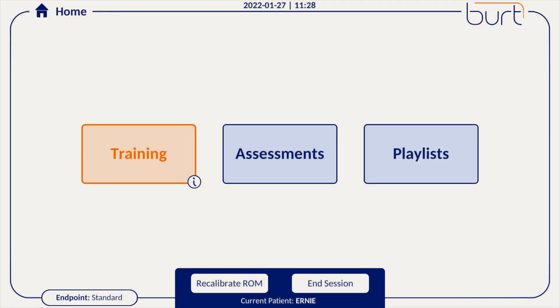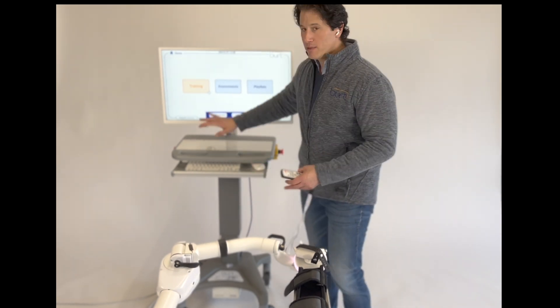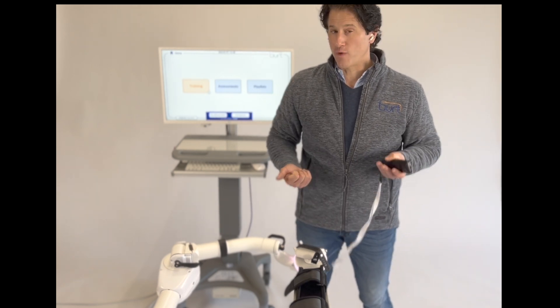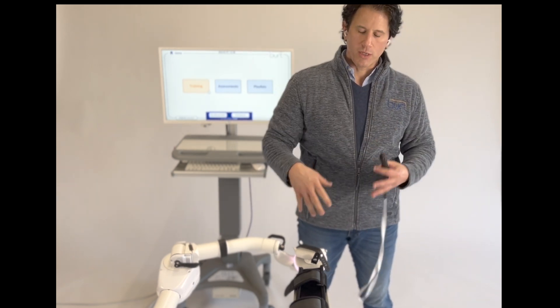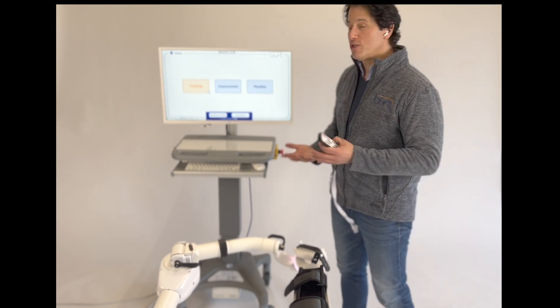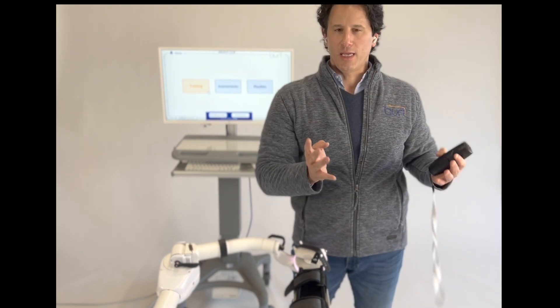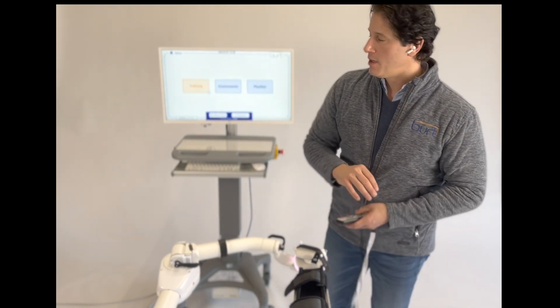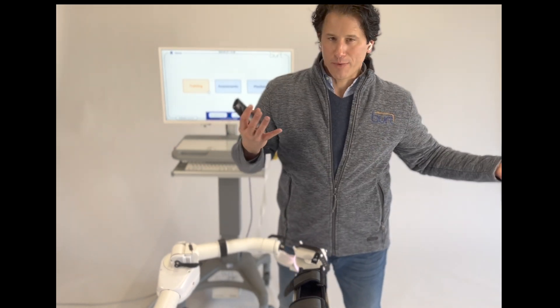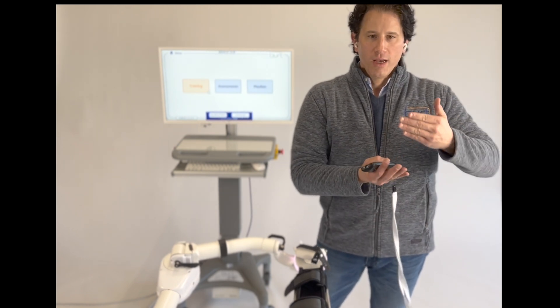We have three modes: training, assessments, and playlists. Most of the time you'll spend with BERT is in training — that's where all our activities and games are. Assessments have their place too: we have strength assessments where BERT measures different planes of movement — how strong you are, your overall strength, average and maximum strength — as well as range of motion, displayed as a 3D image and in cubic feet, showing the volume of their movement. Playlists work like Spotify or Apple Music, where you string together a bunch of different activities to create a 15-, 20-, or 30-minute set. But most of your time will be spent in training.